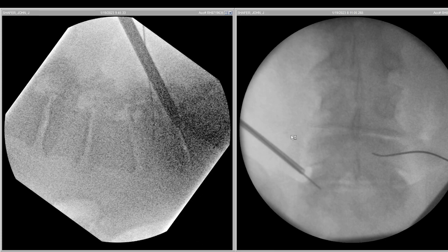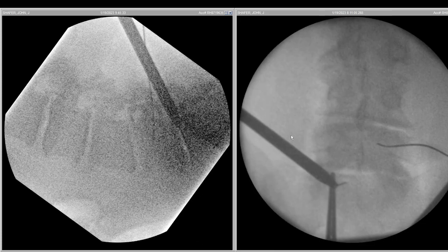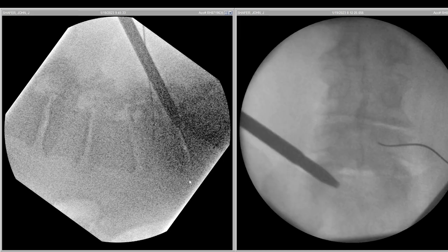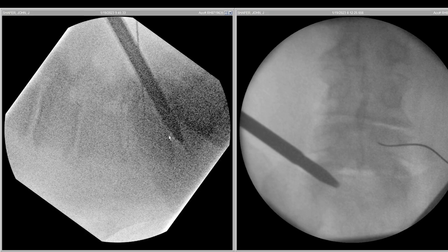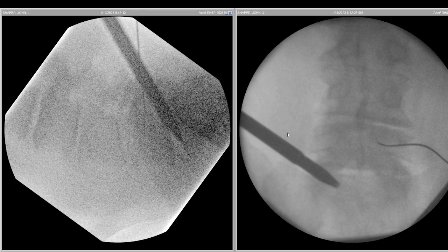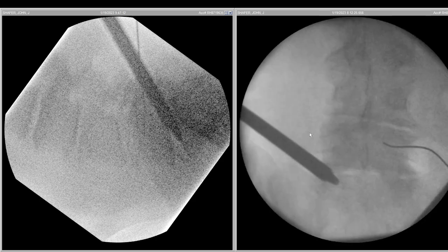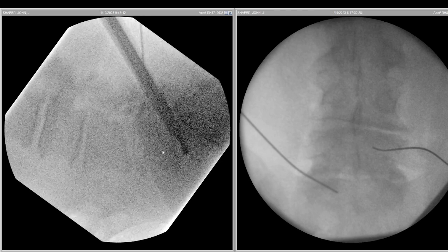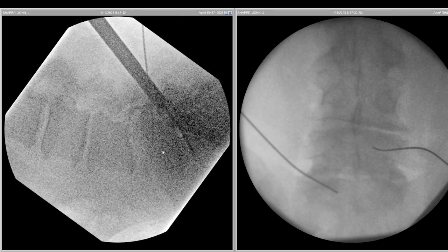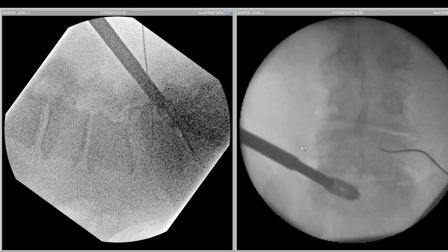We use a dilator that helps us enter the disc. You see the end of the guidewire is a little bent — we have to correct that before we remove it. Even though the quality of the picture seems poor, we can see the posterior and anterior aspects of the bone. We perform the discectomy, prepare the end plates, and put the first cage in.